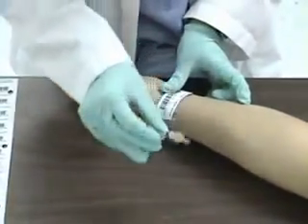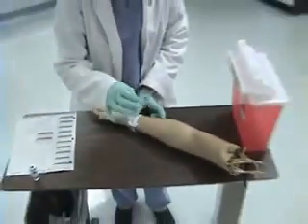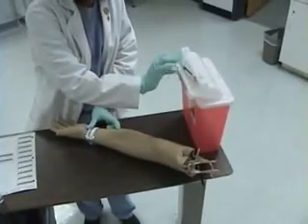At this point, using my safety device on a tabletop, I will cover my sharps and immediately place them into my sharps container.